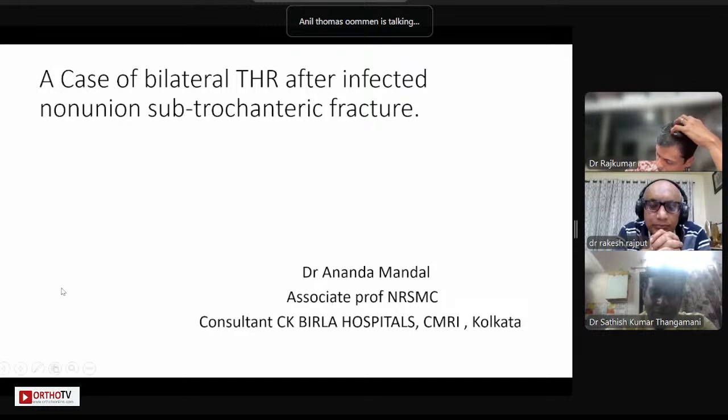We have also realized one of the Zimmer augments. If you combine just one augment, you don't have to use a huge posterior superior one, because the single augment costs only about 60 or so. This is how to titrate the cost. And with a bone graft, that gives you good long-term stability as well. You can use it with one of the porous coated cups from one of the other companies. You don't have to use the TMT type of thing. That's how you bring down the cost.